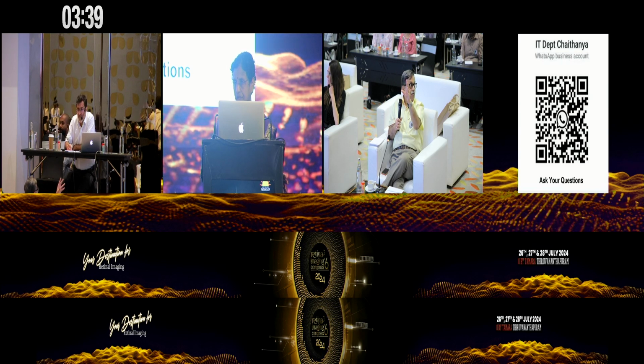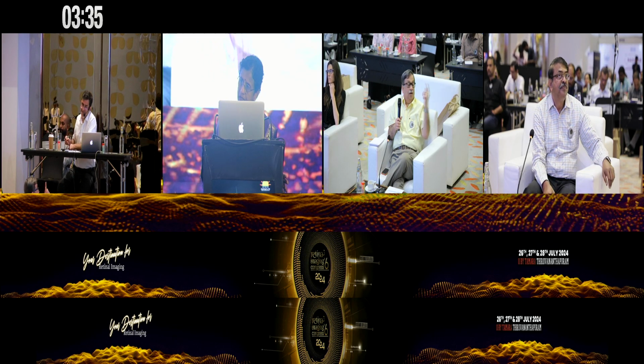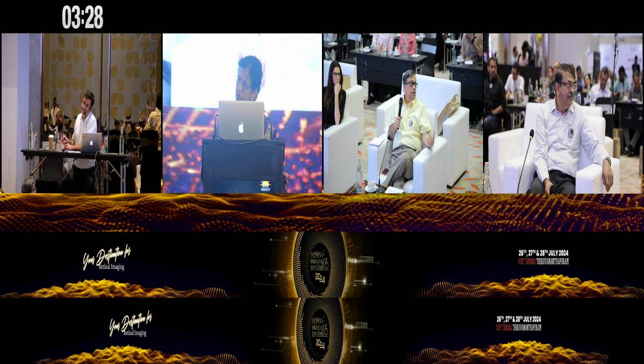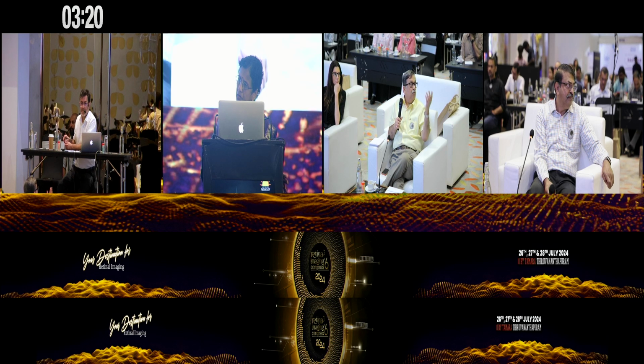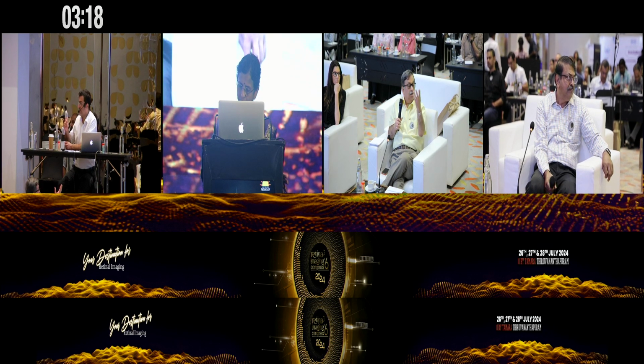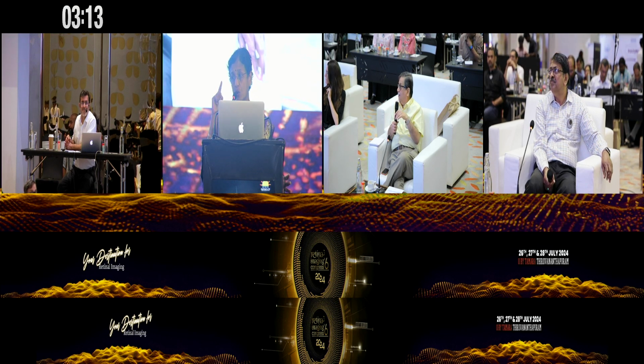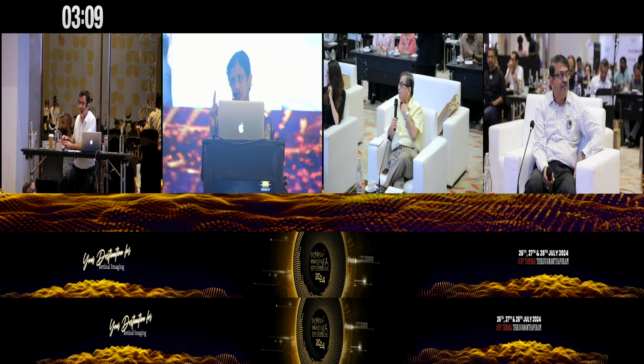For example, if you have this crystalline drusen you're talking about, if it's extrafoveal, it doesn't really matter, isn't it? Supposing there's one such, if it's foveal, it's a huge problem. But if it's extrafoveal and it's only one such, and the rest are only a few small drusen, the whole thing changes. Oh, I need to stress that a calcific drusen is a sign that the whole of the Bruch's membrane is calcified. So we have to be very careful, even if you see one calcific drusen. So would you consider that for a high risk case? Yeah, it is a high risk case, yeah.